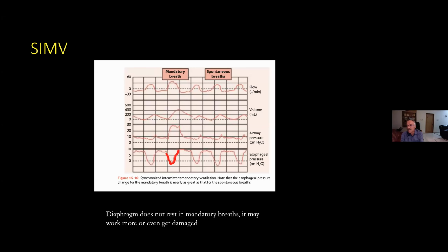How does your ventilator know that at 6 seconds your breath is coming? It doesn't know, isn't it? You have not looped your brain and your ventilator. So your diaphragm is going to contract irrespective of what breath you are giving. If you are giving a pressure support breath, it is contracting. And if you are giving a mandatory breath also, it is contracting.